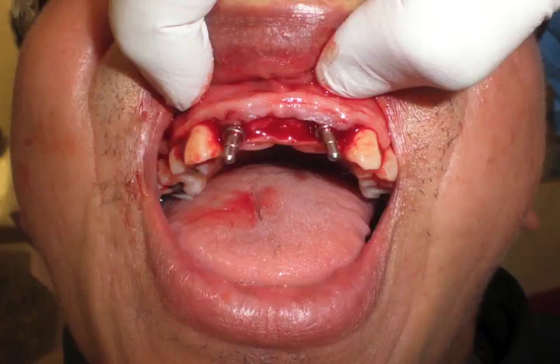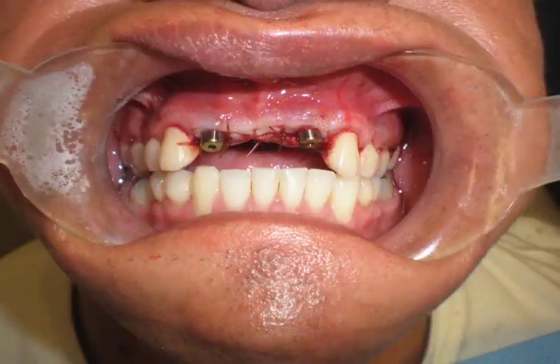A full thickness flap was placed and two Nobel 4.3 by 13 millimeter regular platform implants were placed. Here you can see in this first picture a verification picture of the angulation and depth of placement of those implants, and that certainly looks satisfactory — you can see they parallel the canines. In the next photo you can see we sutured him back together, placed five millimeter healing abutments, and allowed the case to heal. This took place over about a six-month period of time.